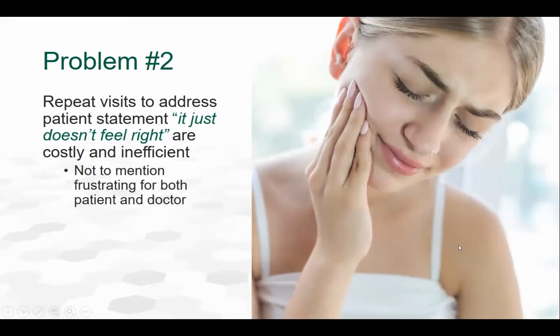Problem number two, how often have you heard a patient say these words? Something just doesn't feel right. It's still high. I have sensitivity on this tooth. So for you as the dentist, how hard or easy is it for you to resolve that issue? As you're trying to help the patient, what is the impact for you? Is it causing extra time in the chair, returning visits by the patient, unscheduled visits and appointments, disruptions to your schedule? Ultimately, these situations are extremely frustrating, especially if you're unable to resolve the problem.